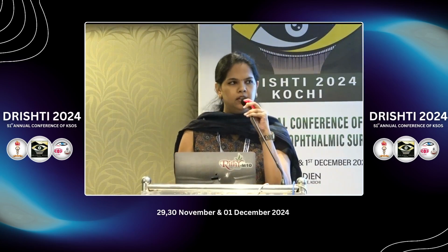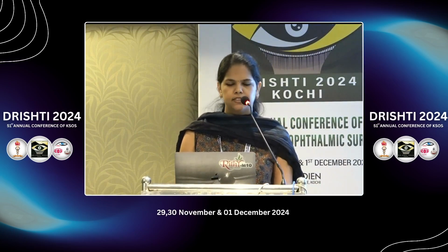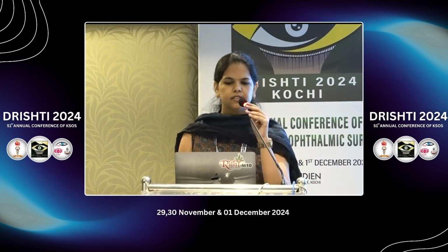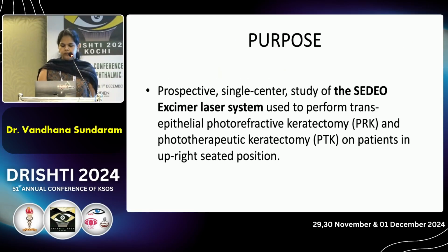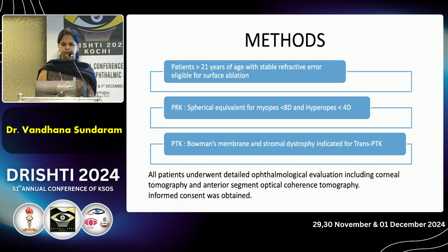Morning everyone. Our study is about the outcomes of the Sedeo Excimer laser system, the world's first surface ablation in upright seated position. I do not have any conflict of interest or any financial disclosures. The purpose of the study: it was a prospective single center study of the Sedeo Excimer laser system, which is used to perform trans-PRK as well as PTK on patients in upright seated position.